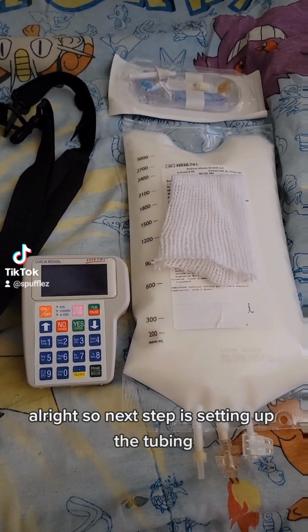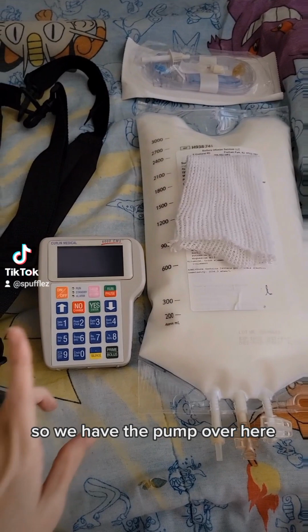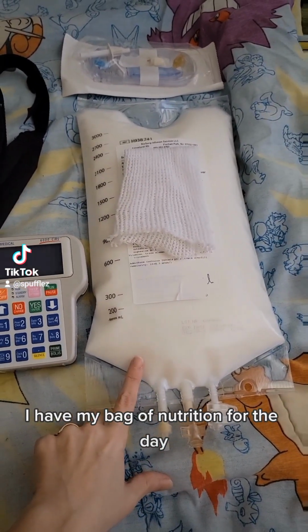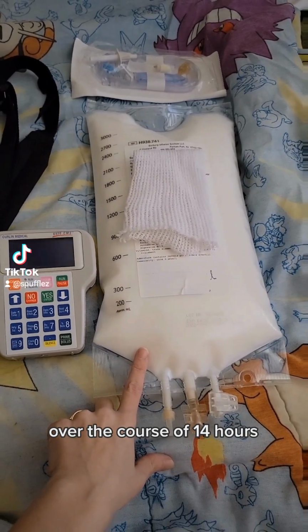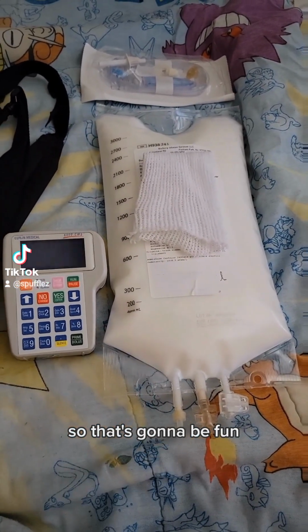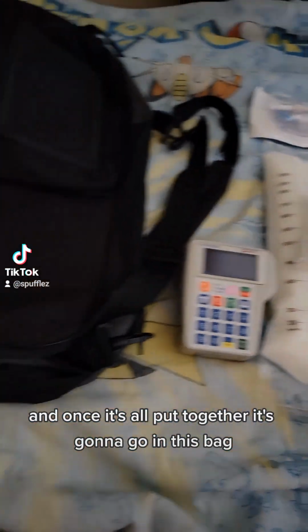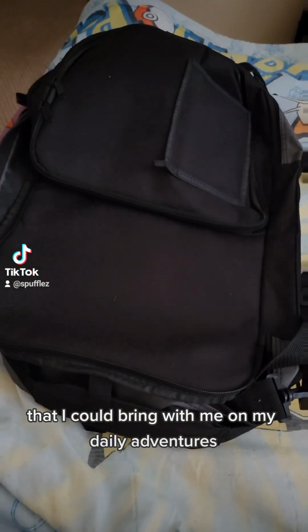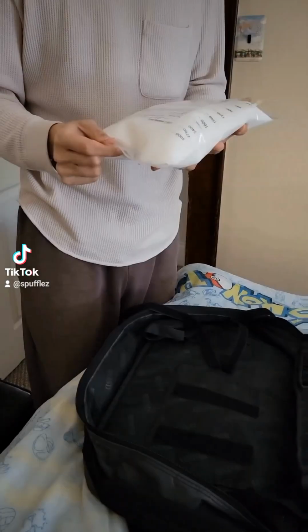All right, so next up is setting up the tubing. So we have the pump over here. I have my bag of nutrition for the day, which I'll be infusing over the course of 14 hours. So that's going to be fun. And we have the tubing back there. And once it's all put together, it's going to go in this bag that I can bring with me on my daily adventures. So let's get started.